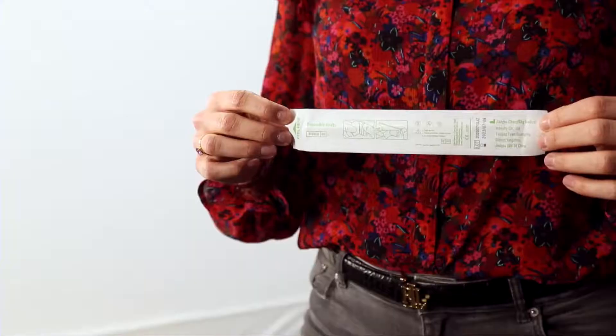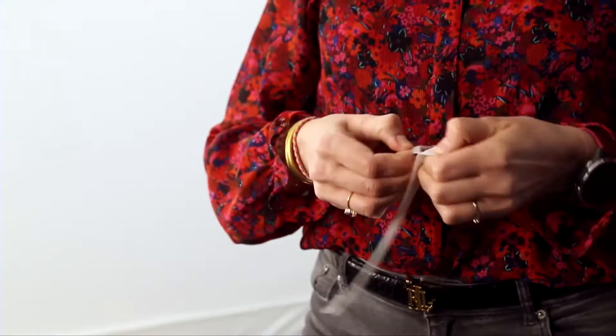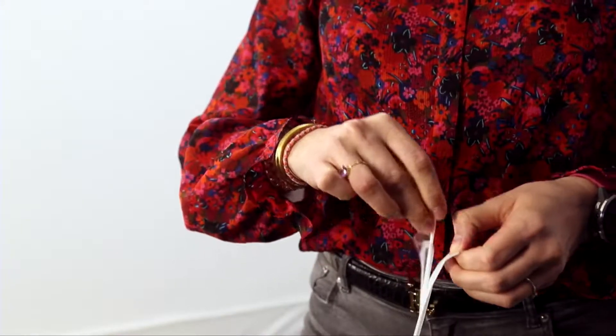First, blow your nose briefly into a tissue. Remove the swab from its packaging by simply pulling apart the loose ends of the packaging. Remove the swab by the shaft.